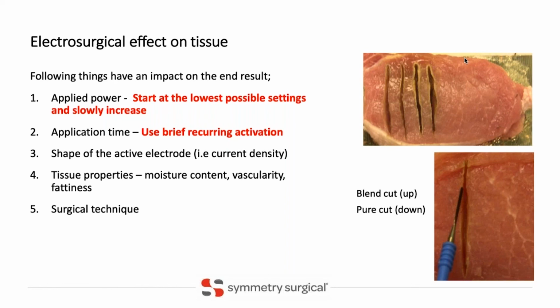I mean, that was something that was a bit of a surprise to me when I was learning about it, because I think there's an automatic assumption that in delicate areas you're going to have less power, but certain urology procedures, where there might be moisture or saline involved, obviously need higher power. So there's not always an obvious solution in terms of the tissue and how that would be approached. Yeah, no, you're absolutely correct. In urology, you need higher power, so that's absolutely correct.